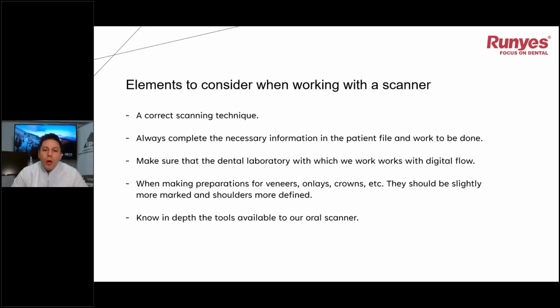Also, when we work with digital dentistry, we must be certain that the lab technicians we work with also understand the digital dentistry world. It doesn't make sense if we do digital dentistry, we have the scanner, we scan our patients, we send the file, and they don't work with digital dentistry.